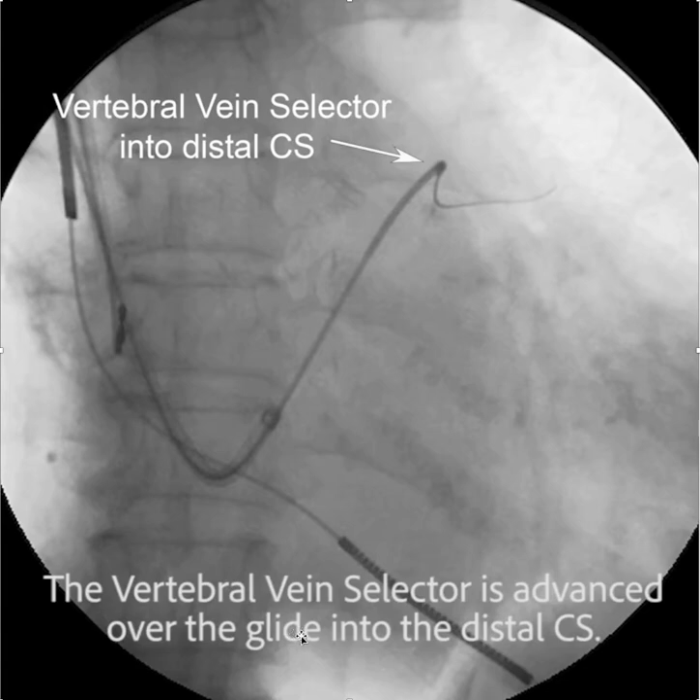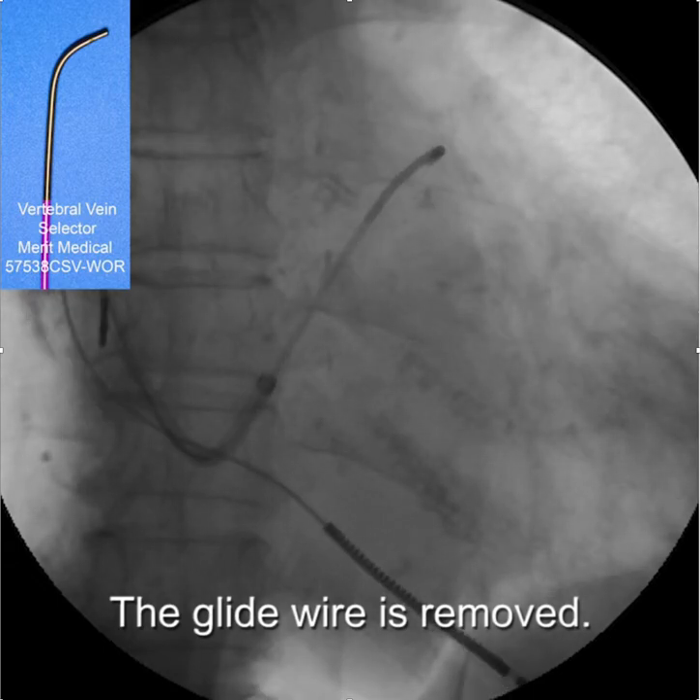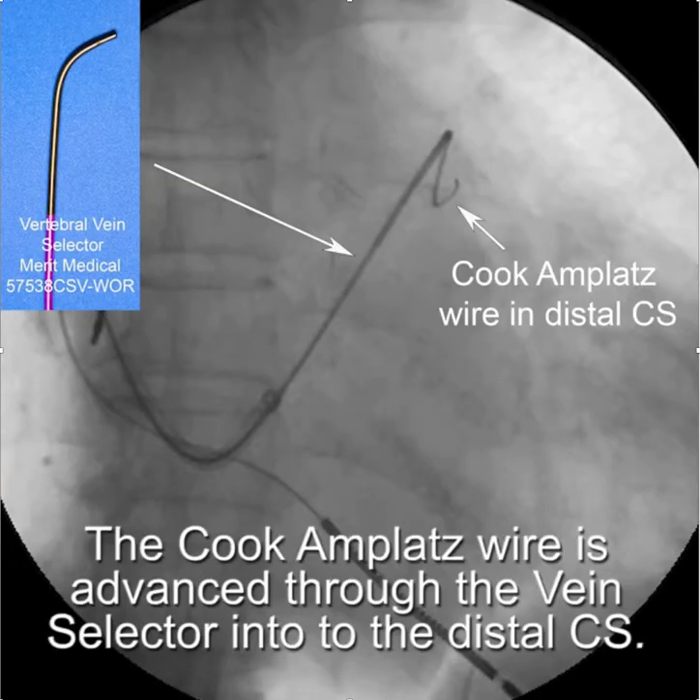Once the vein selector is advanced over the glide wire into the distal CS, we're going to replace that glide wire — remove it — and then replace it with the Cook Amplatz wire, which is advanced through the vein selector into the distal CS.